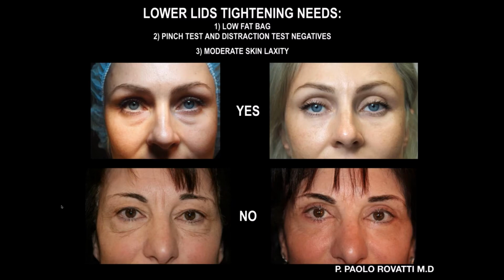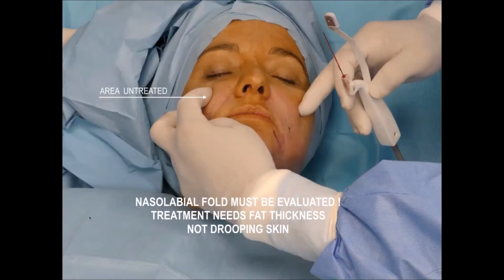So the first case where I wrote yes, this is good for treatment. The second one where I say no is not good for treatment, but this patient had a previous blepharoplasty, complete upper and lower. For the nasolabial fold, we must evaluate the treatment just if there is fat and not drooping skin, because sometimes we have only skin that is sagging down.